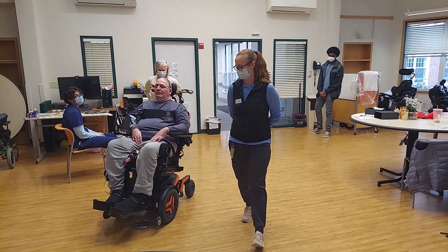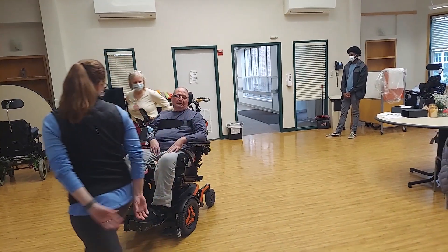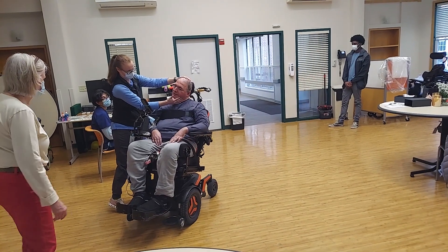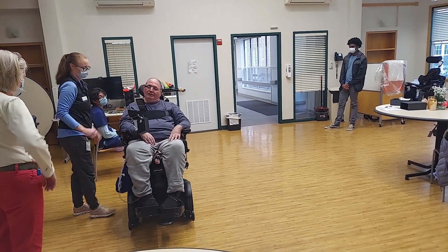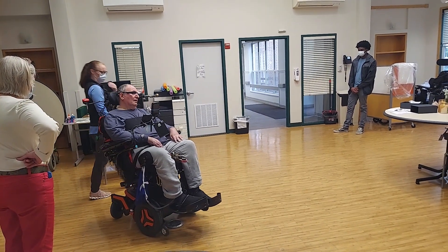Awesome! Okay, now do you remember how to turn? Turn your head. Turn your head back — just so you know, that's fine. Okay.